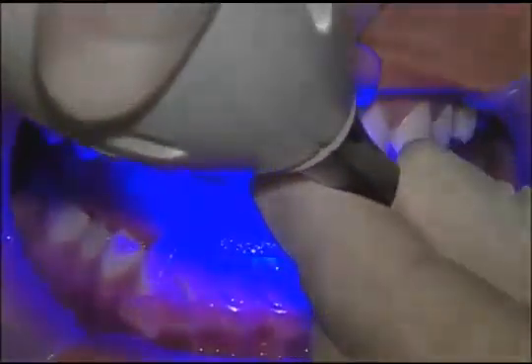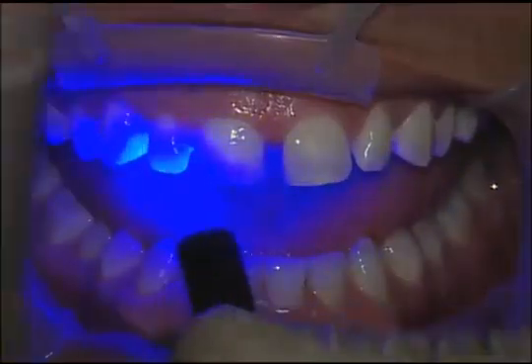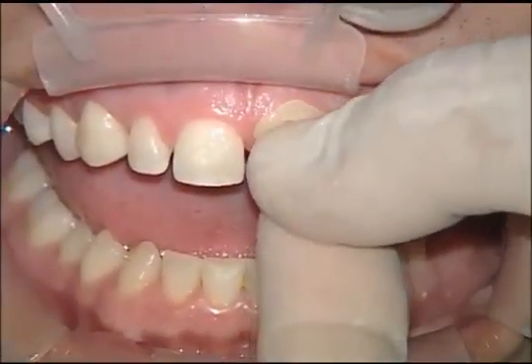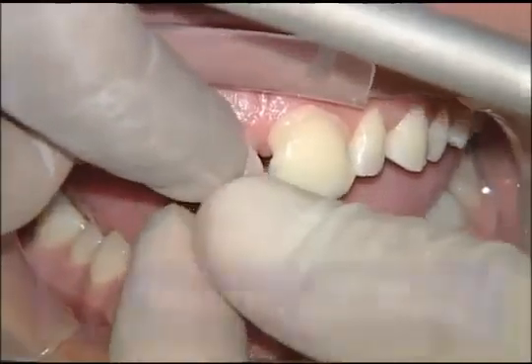Depending on the thickness of your veneers, you could wait and cure it once the veneer and the cement are in place, and that's perfectly acceptable as well. But having tried on these veneers already, I know I'm going to be able to put that adhesive on, cure it, and go forward.